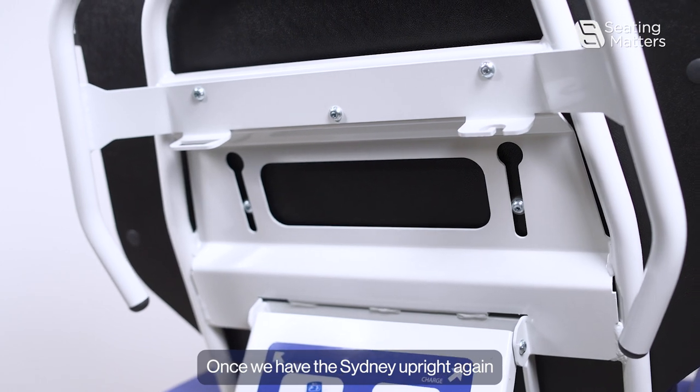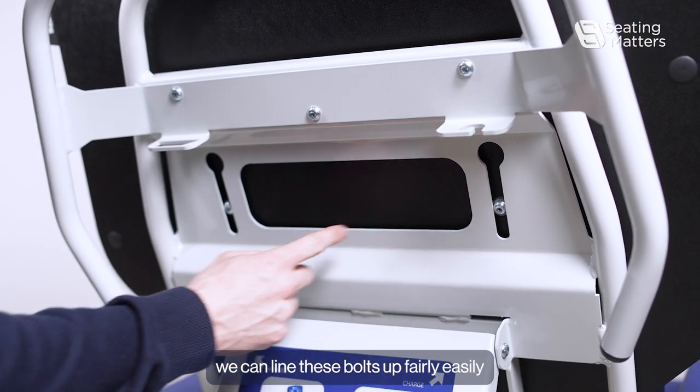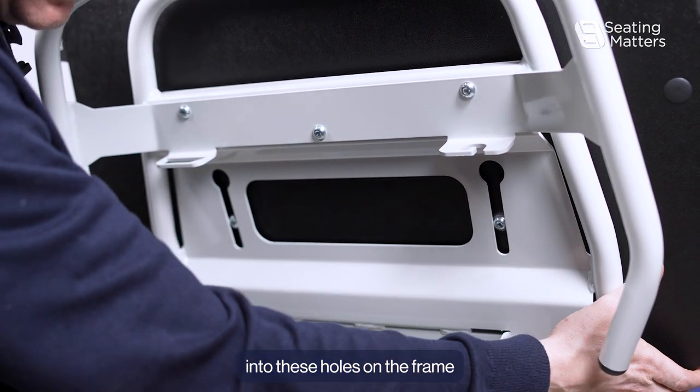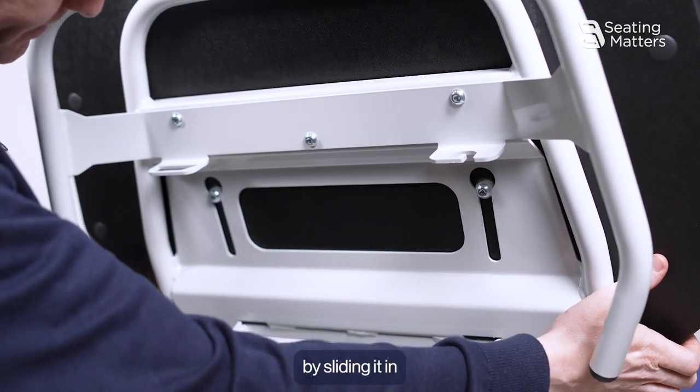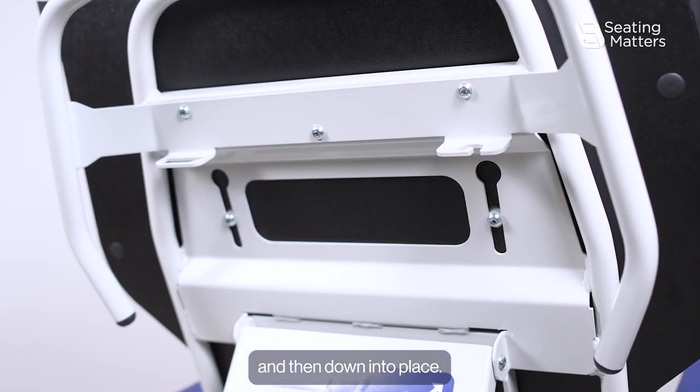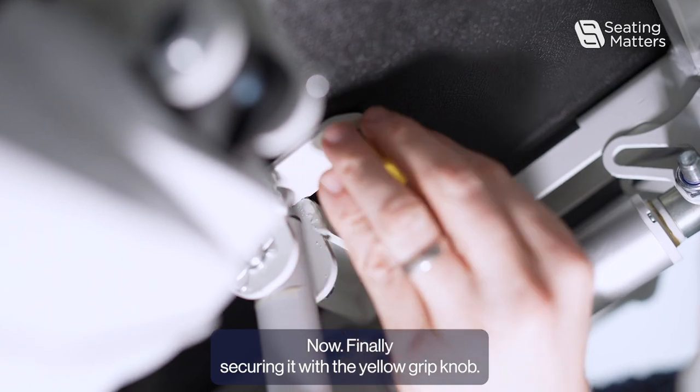Once we have the Sydney upright again, we can line these bolts up fairly easily into the holes on the frame by sliding it in and then down into place. Now finally secure it with the yellow grip knob.